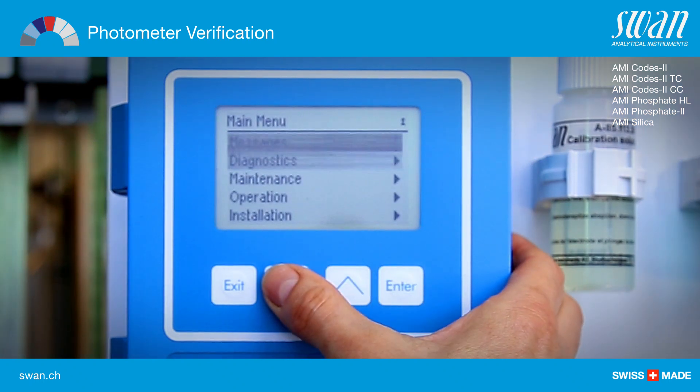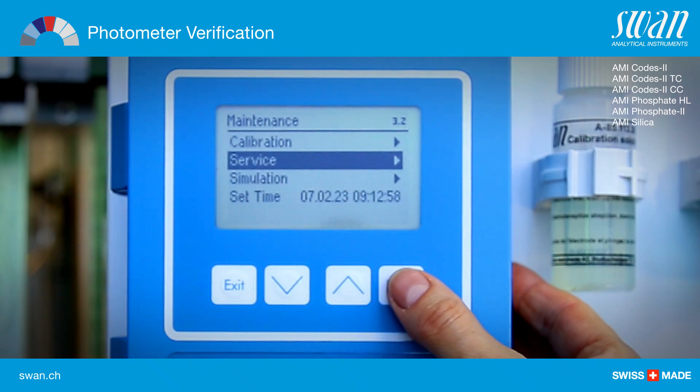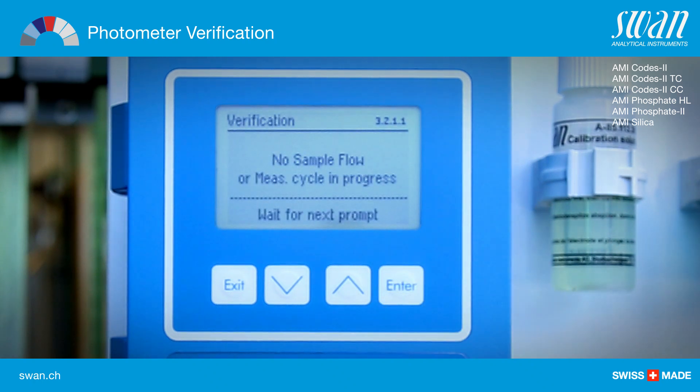Go to the menu point maintenance service verification and follow the instructions on the screen.